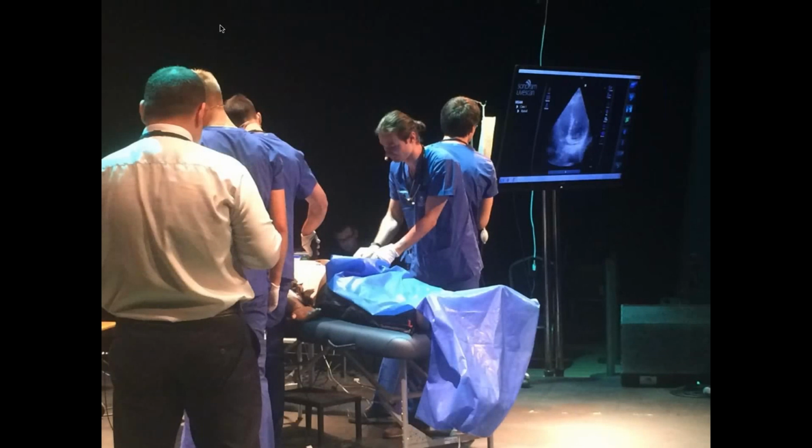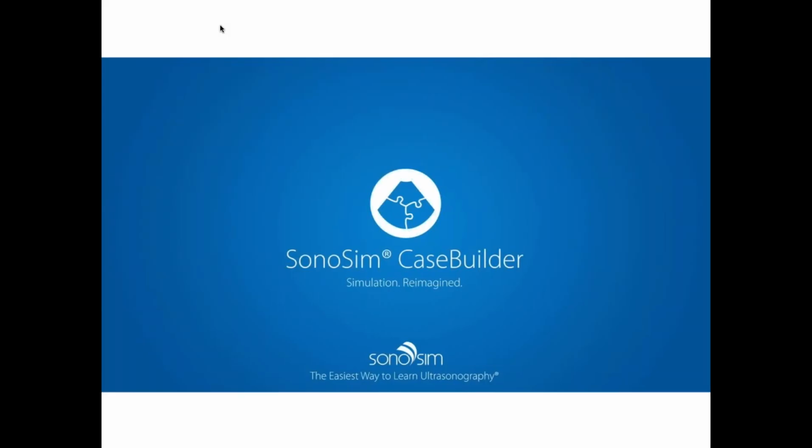This is how it's being used in the context of an immersive simulation. And again, in order to accomplish this, we had to create a tool that would allow simulation specialists and educators to create cases that would match their educational and testing objectives. Now we're leveraging a technology called Live Scan, and Live Scan basically allows you to pair the SonoSim platform with SonoSim tags that are placed on either a standardized patient or a mannequin. And when the probe makes contact with those tags, it loads the appropriate data sets that you've programmed.